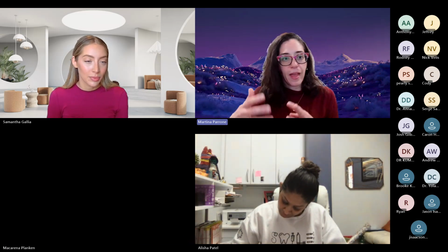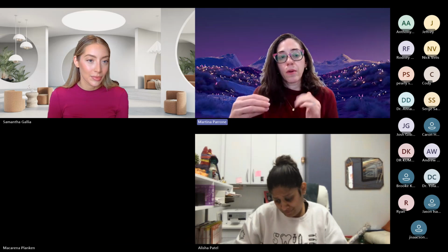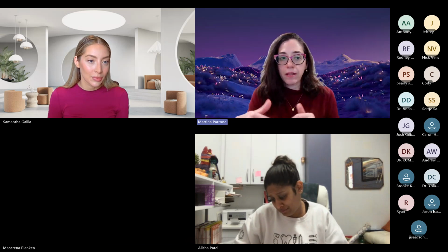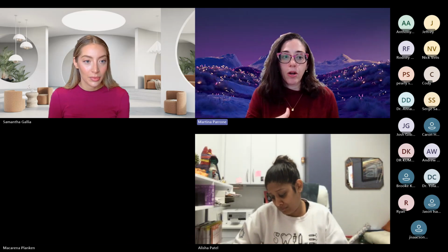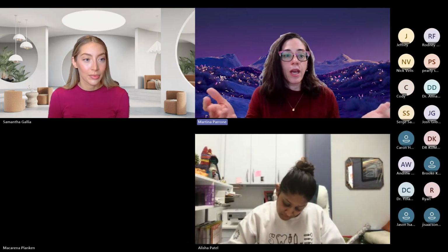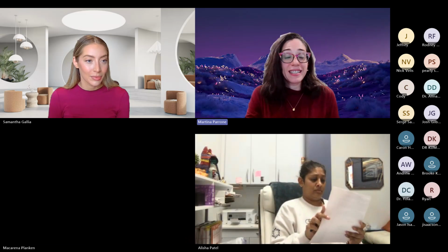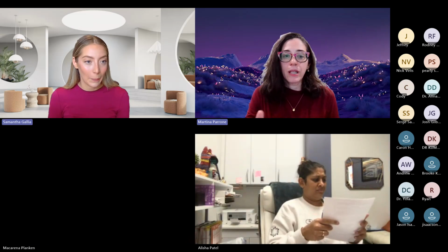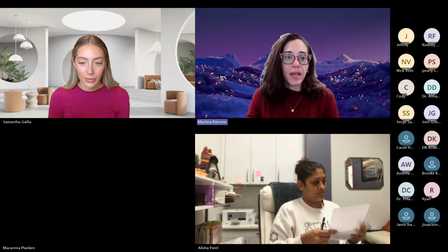So the iCat Flex, if you are able to get your clinical questions answered at a very, very low resolution, so it's a little bit grainy, it doesn't look perfect, the radiation dose is actually smaller on that than it is for many Ceph and Panos. So it is one of the things Samantha talked about: it's individual medicine. You have to really look at what your options and alternatives are and pick the best thing.